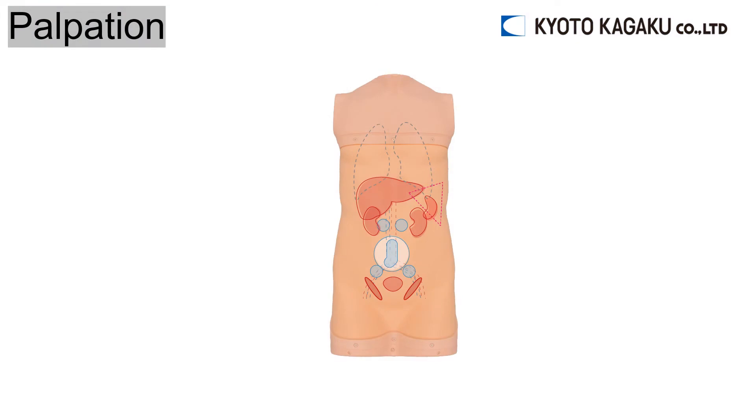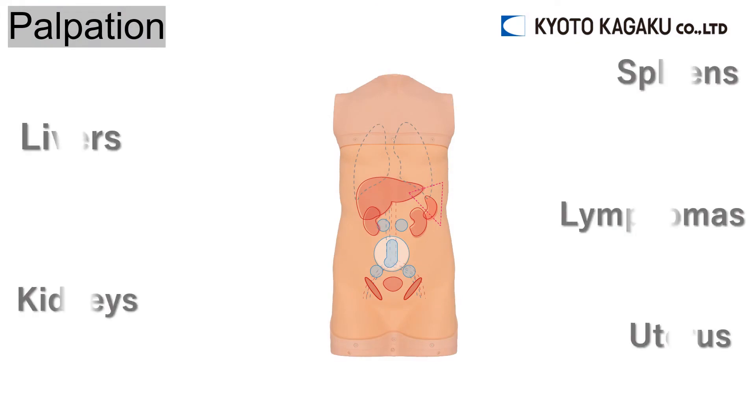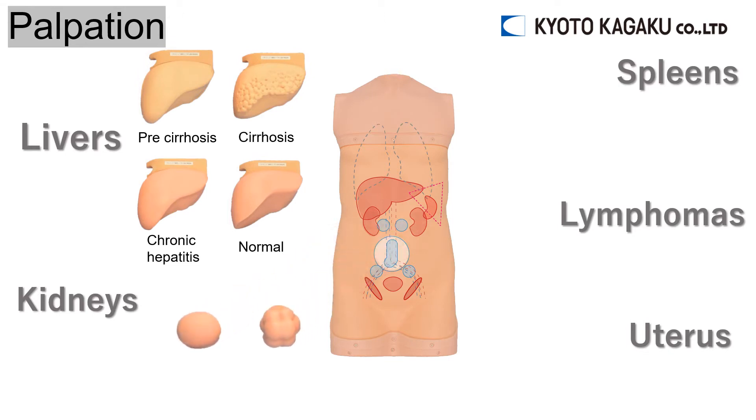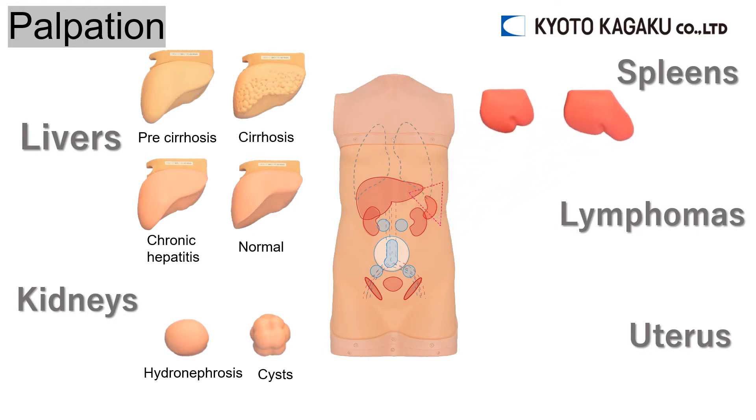A wide variety of organs can be placed freely inside the simulator to practice palpation. Four livers are included: pre-cirrhosis, cirrhosis, chronic hepatitis, and normal. Also included are hydronephrosis, cysts, and two spleens — slightly enlarged and enlarged.